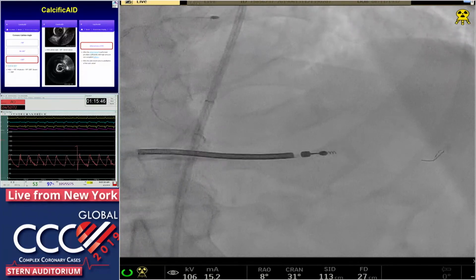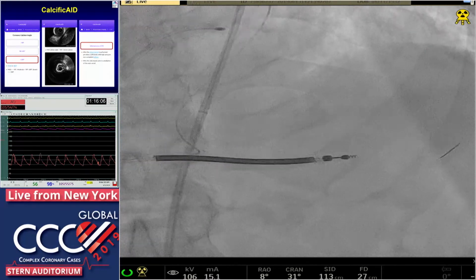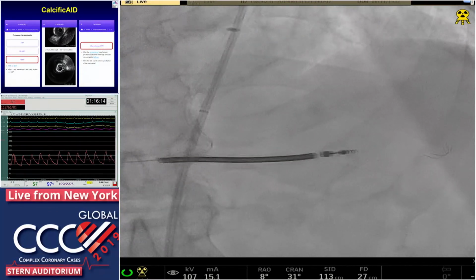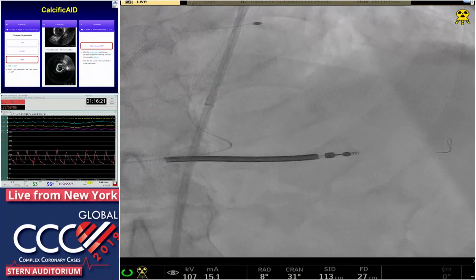Dr. Samuel Matthews? I totally agree with that. When you have a reduced flow in the LAD, I would be very concerned about starting with the 1.75. Though Dr. Sharma said that after opening the first run of rota, the slow flow will come down, if the burr size is 1.75, I think it's the opposite. The chances of a slow flow would be higher. I would prefer at least the first run to be 1.25 or 1.5 when the flow is so low.